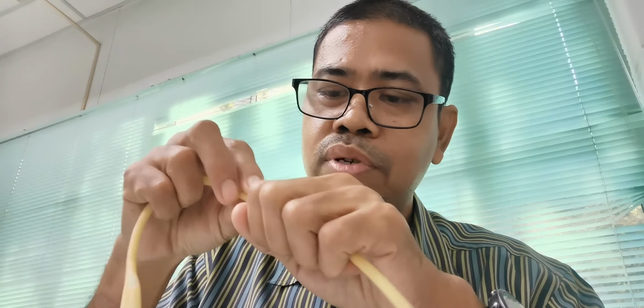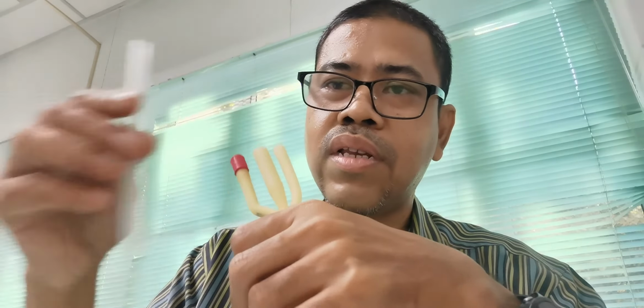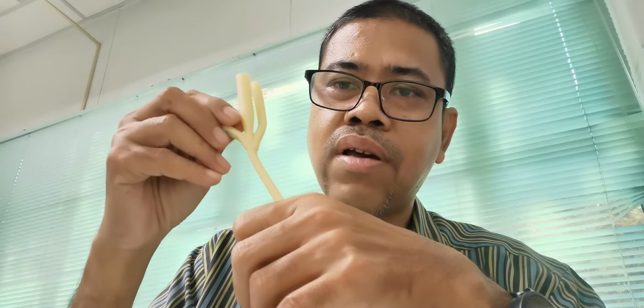How far you insert depends on the two dotted black lines. You push until you see the urine, and then you take out this thing, and you can see the two dotted black lines. In the first place you push it all the way until you see the urine. Then once you release the sheath, you pull out until you see the two dotted black lines. That is the place where you need to anchor.